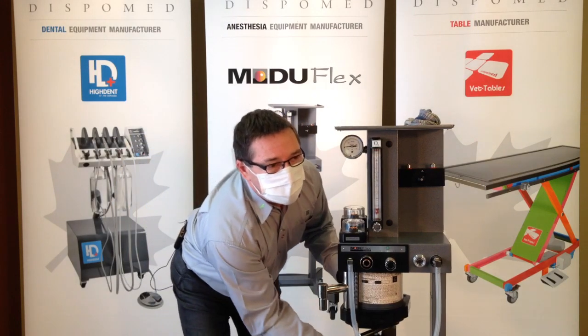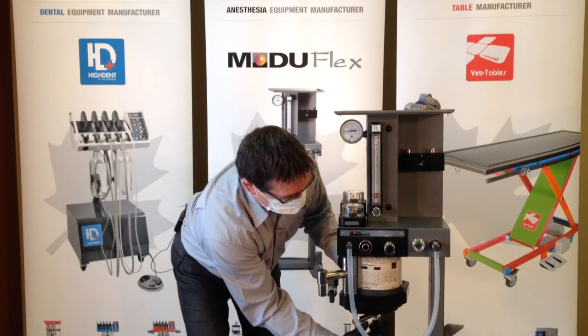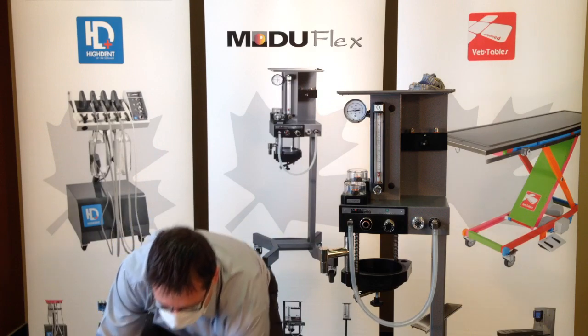Loosen the set screw below the canister. Remove the canister and dump it out.